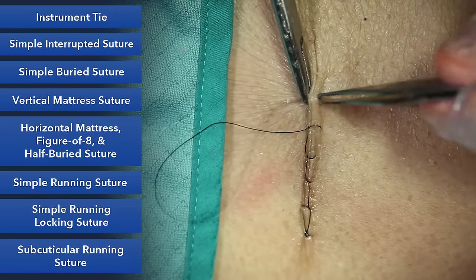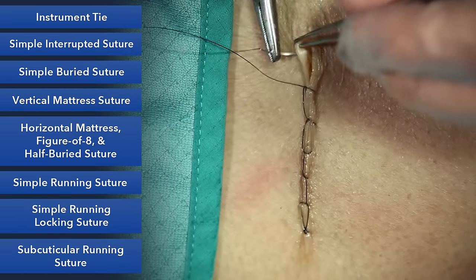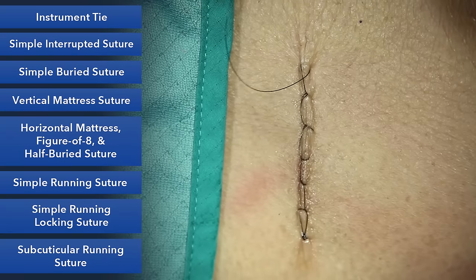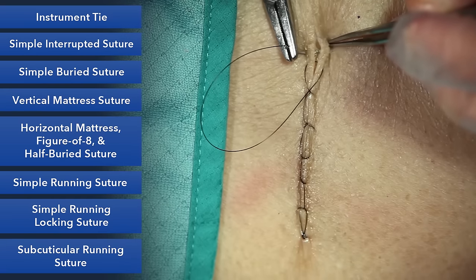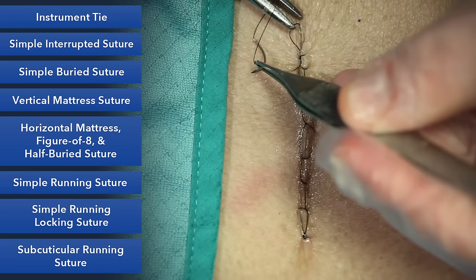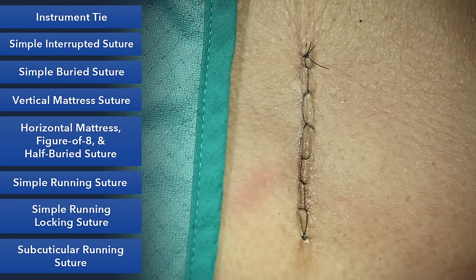So it's not a suture necessarily that you'll use primarily, because I think for scarring purposes you prefer a regular suture. And I will say also, as you become more and more expert at suturing, you'll be able to control your simple suture much better each time locking the suture. And we're going to end this with a simple stitch. And again, when we tie this, we want to make sure we have good tension on the rest of the suture. And that is our running locking suture.